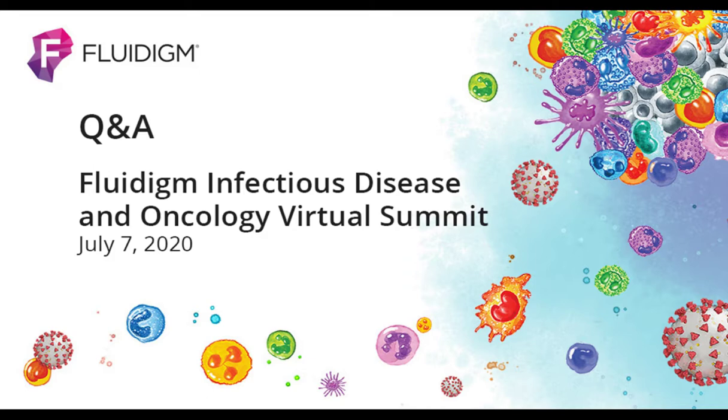Okay, so that's an interesting question. No, there is no extraction as part of the workflow that you heard today for the Advanta product. It starts with saliva and goes through an RT-PCR preamp step without any extraction. So we start with saliva as the sample matrix.